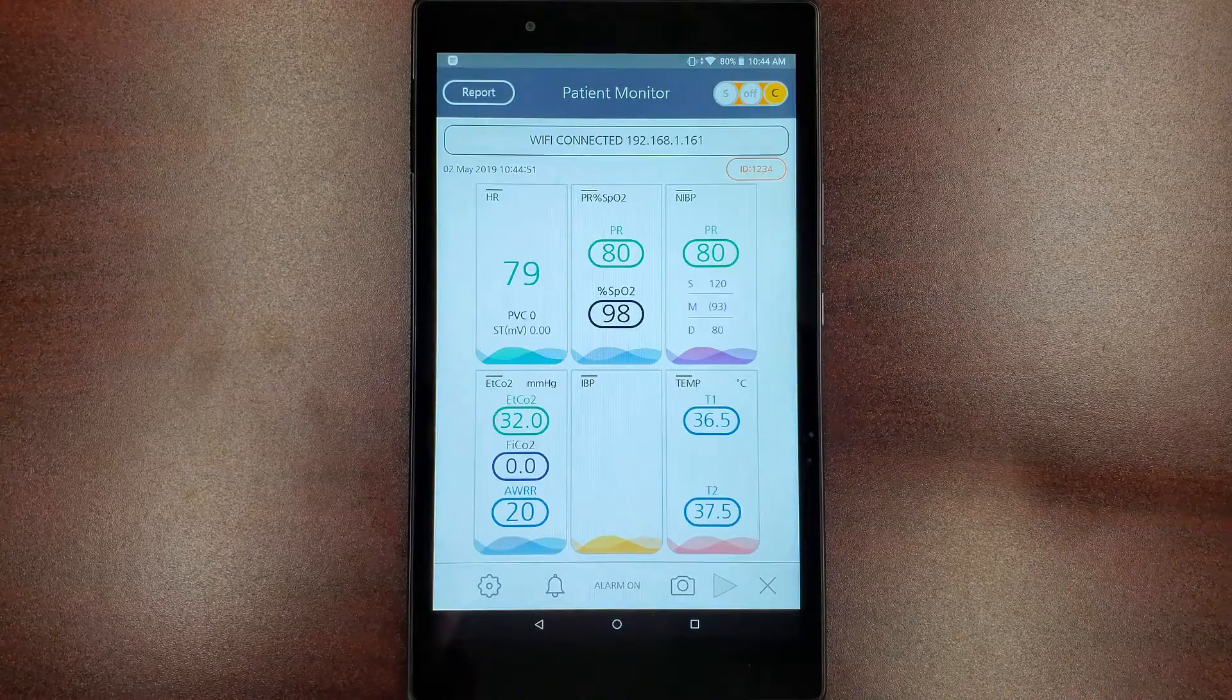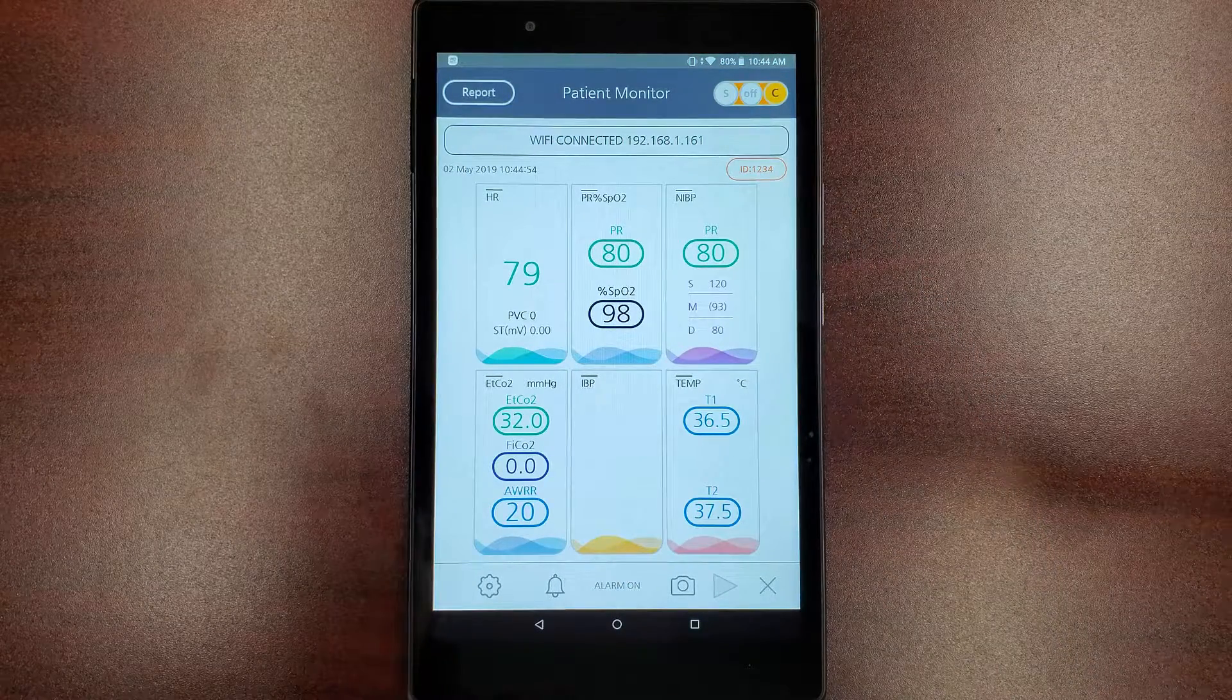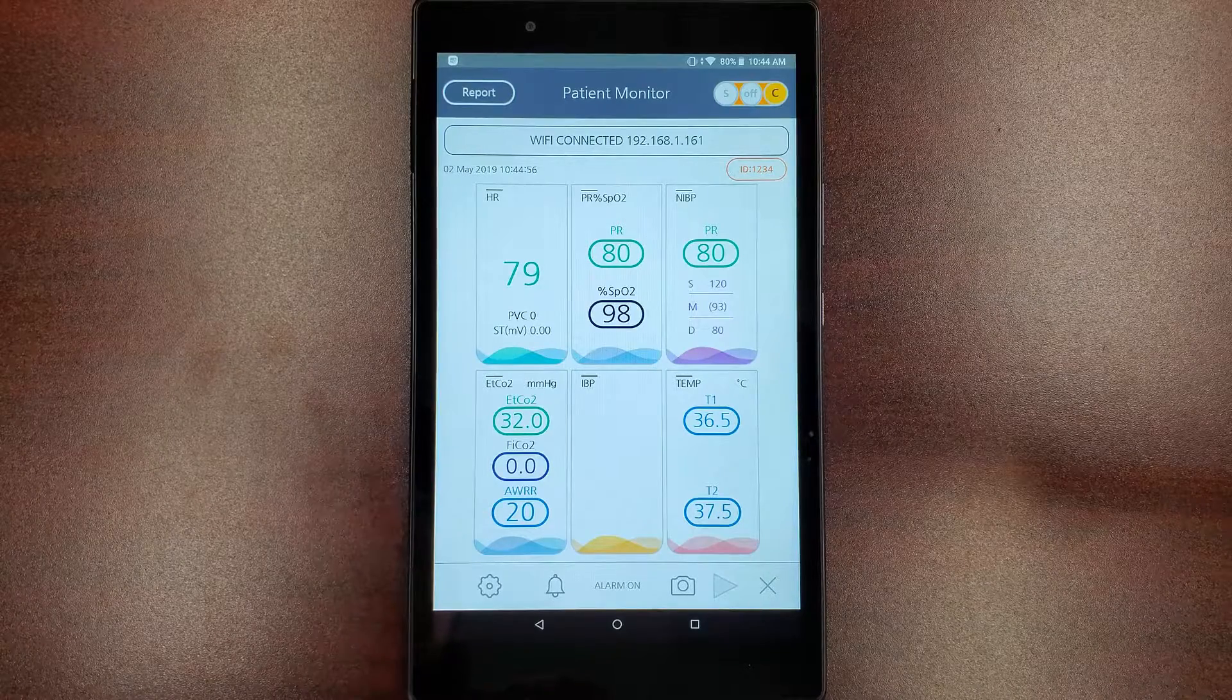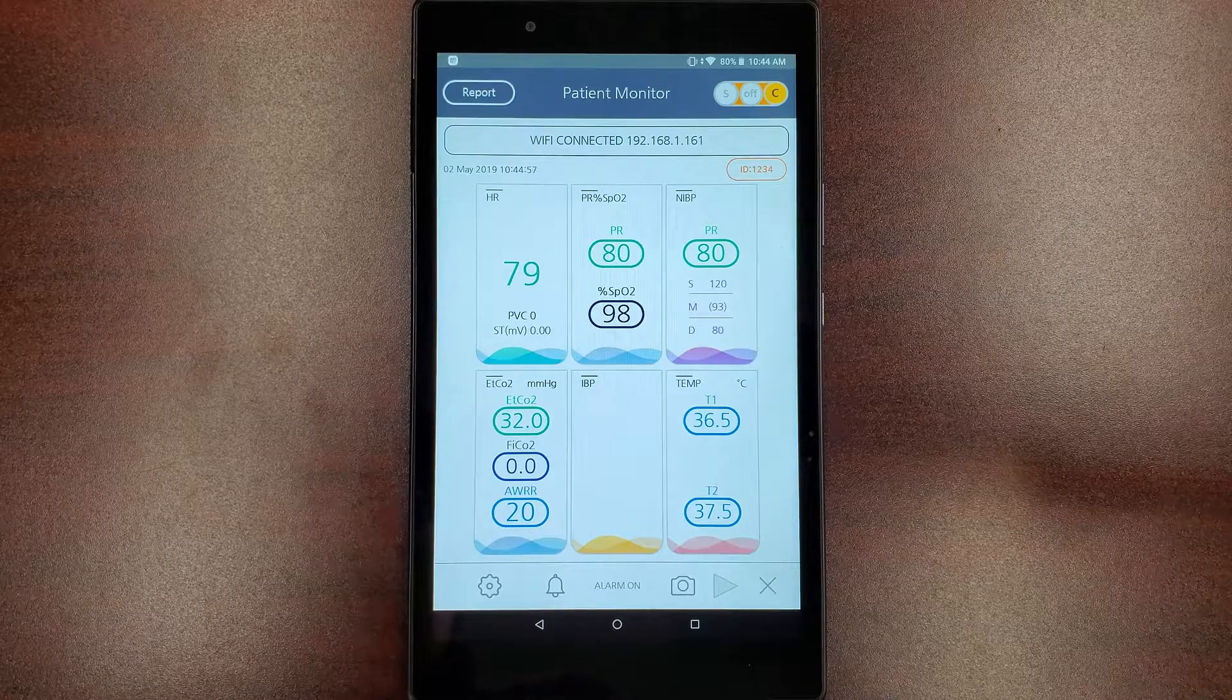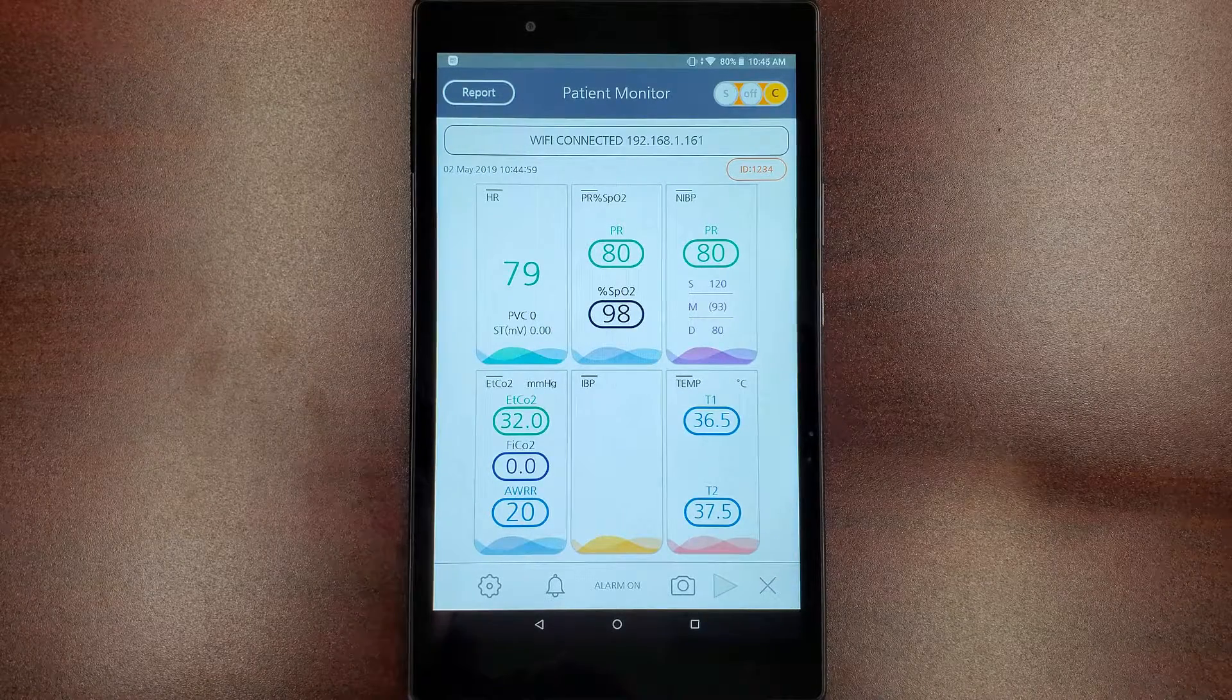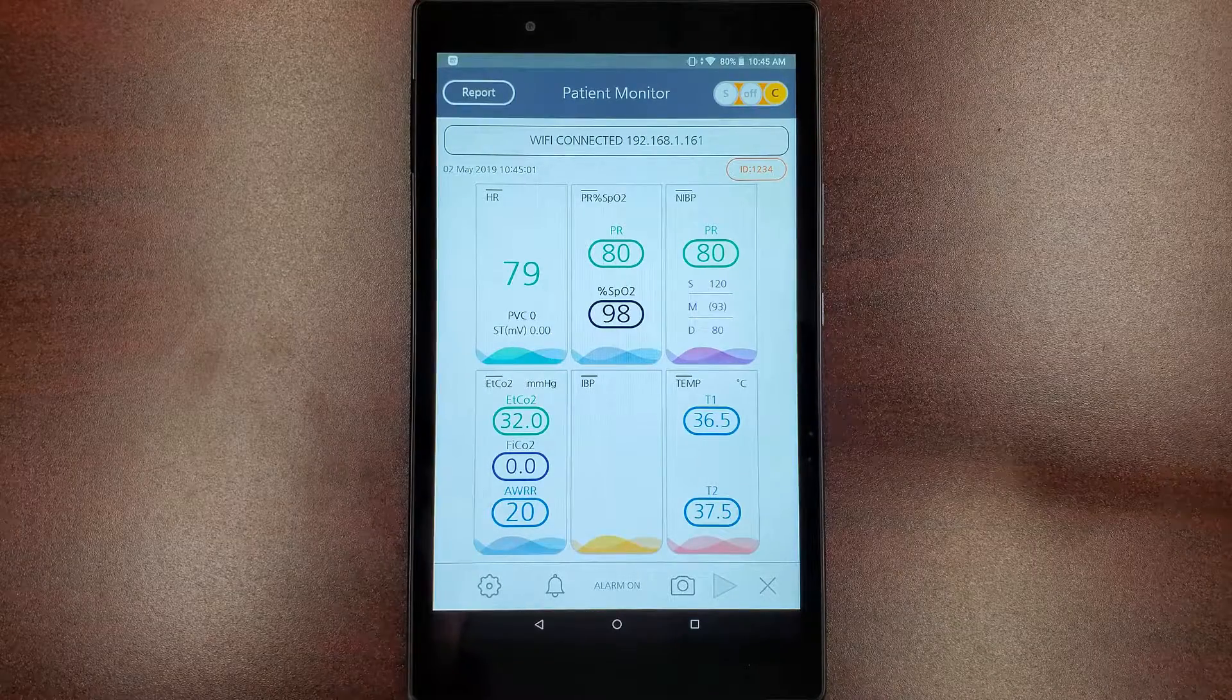Now hit OK and you should be receiving the data from your BT Link computer software. To connect additional mobile devices, follow these steps for each mobile device you wish to connect.